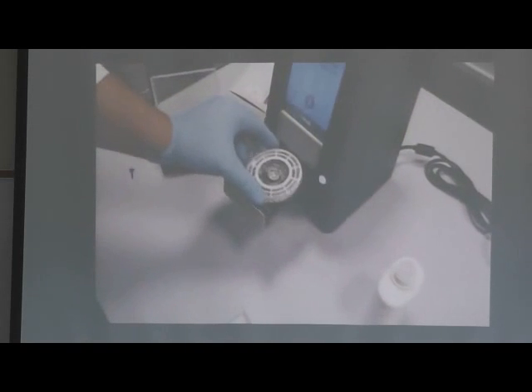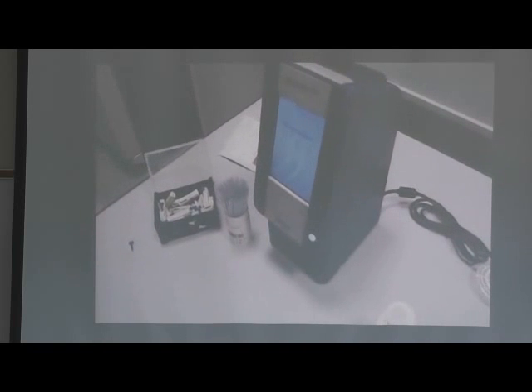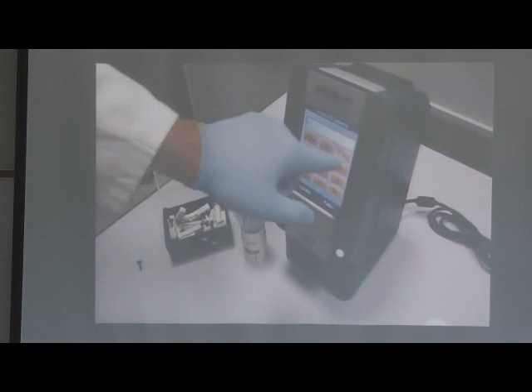So look at this. They just put it in. It's hard to see, isn't it? You see that blood filling up the channel? I see it. Little circle. And now he's showing us a semicircle in there. So he puts it in the machine, and then it's going to spin it and separate the sample out to the different tests. I don't like having that figured out. I don't either. Every time I get blood, I always tell people, this is my least favorite part, when you poke my finger. And then you get the results there in like 5 minutes, I think, of all of those.